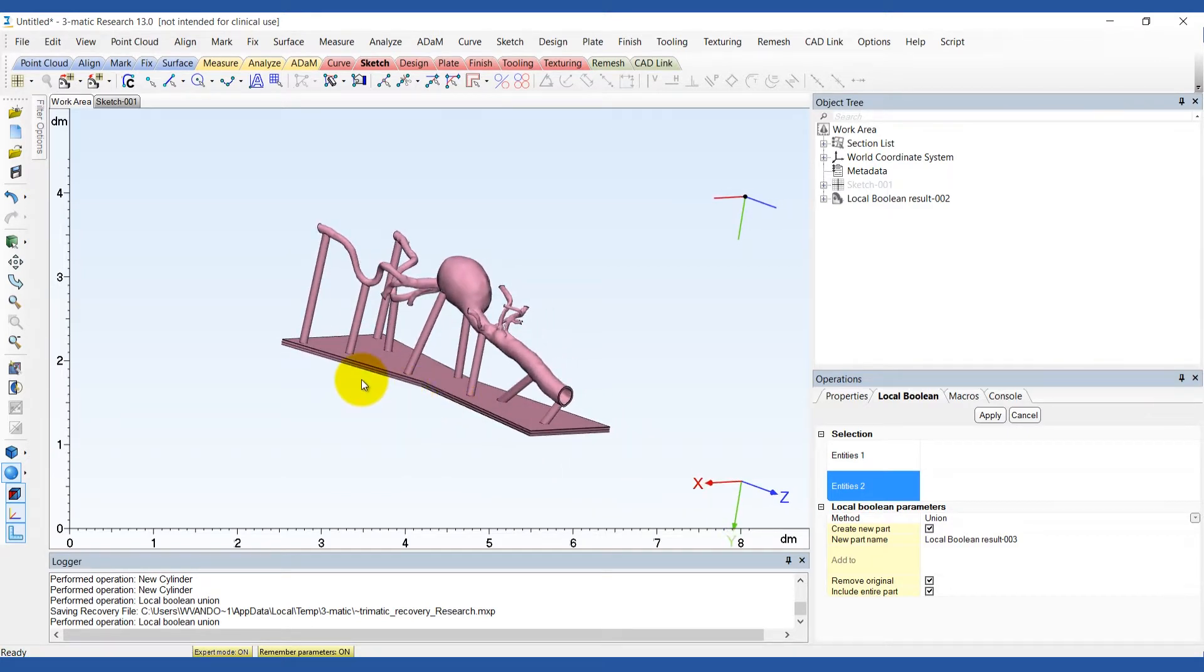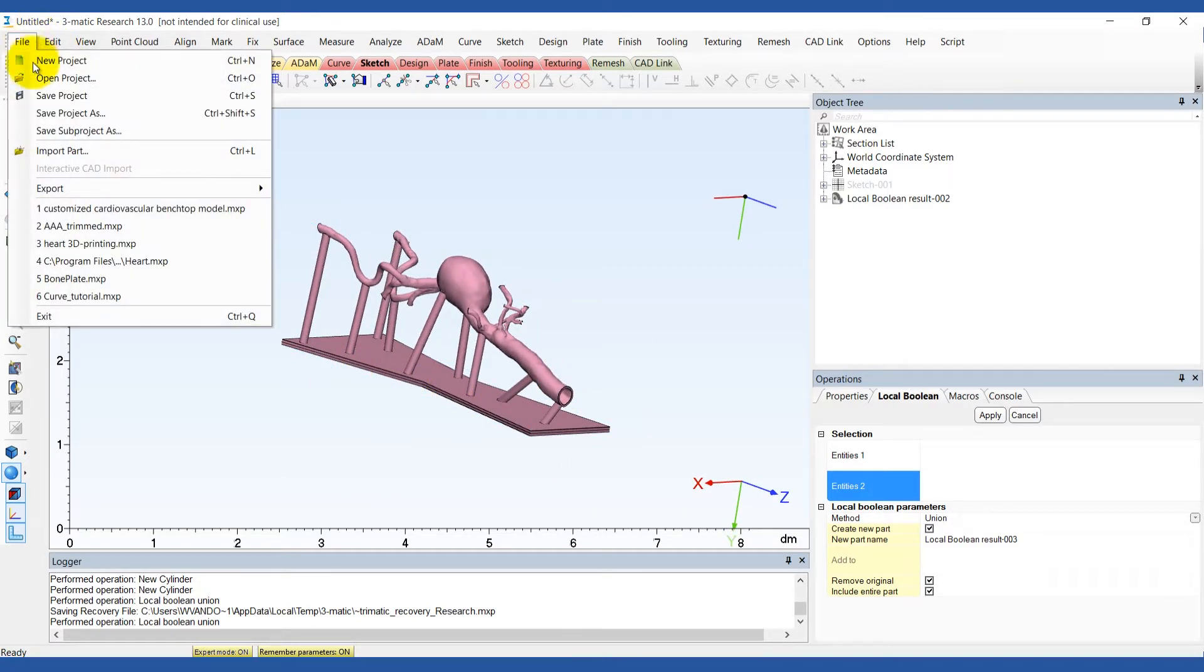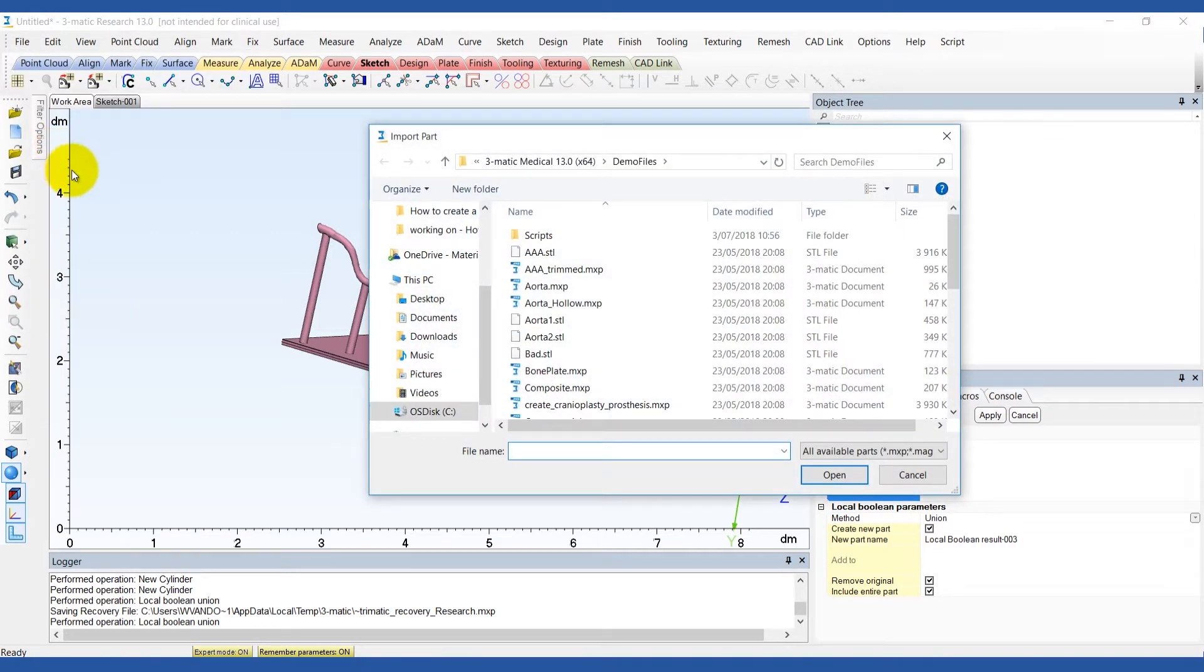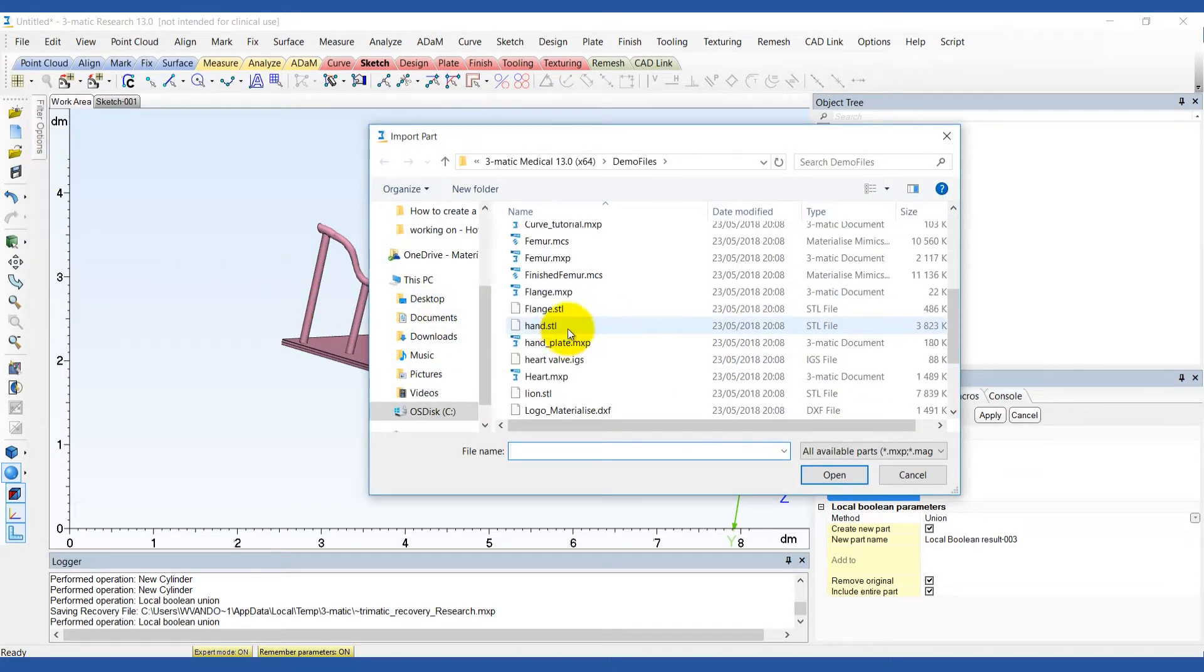Now we can add a flange to the benchtop model. To do this, import the STL file of the flange using the default settings.